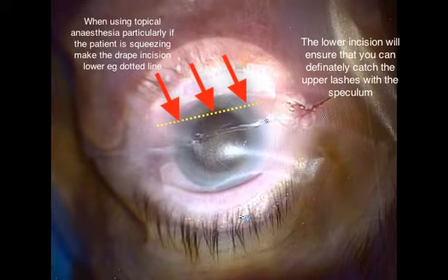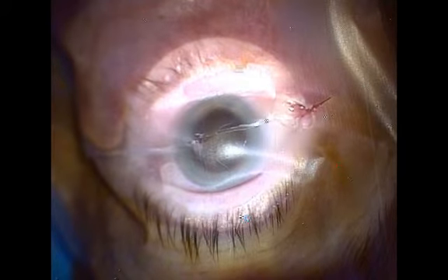If draping under topical anaesthesia and there is any blepharospasm, it can often help to incise the drape lower near the lower lid to ensure one has enough drape to fold back under the upper lid, enclosing the lashes completely and ensuring that the surgical field is completely protected from the lashes.